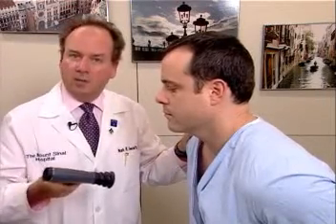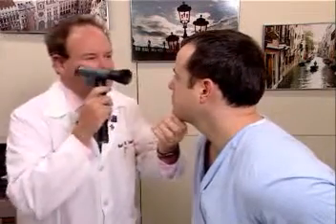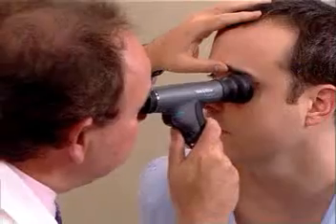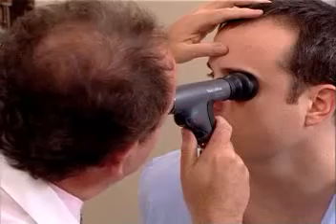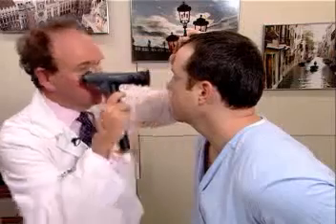A major advantage of this is that many individuals are one-eye dominant, and therefore may have trouble using their left eye to examine the left eye of the patient. With the Panoptic, if you just turn this way, Mr. Johnson, and look straight in the distance, I can actually visualize Mr. Johnson's left retina by using my right eye, as I'm demonstrating now. In addition, of course, I could use the instrument in my left hand and examine the left retina as well.